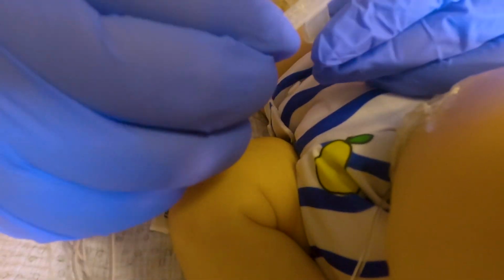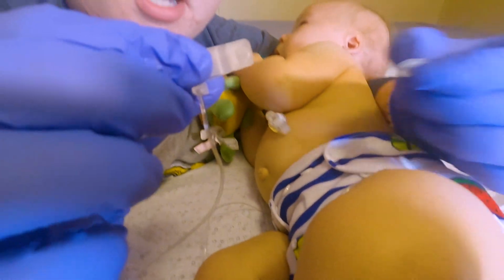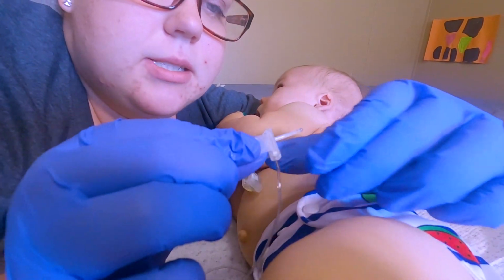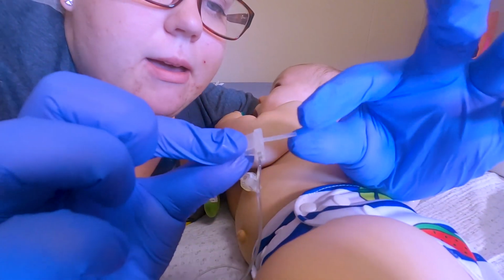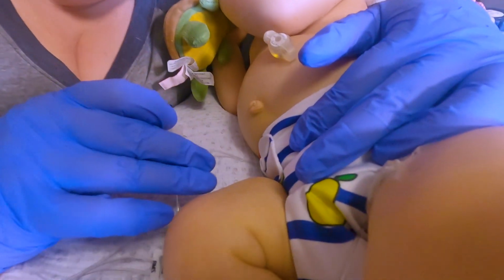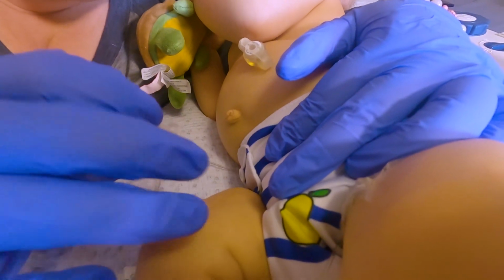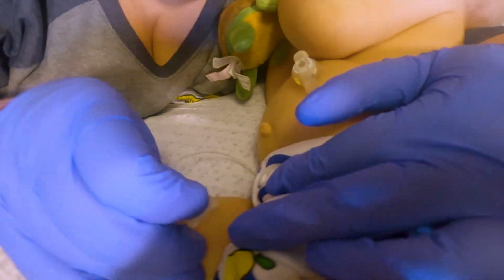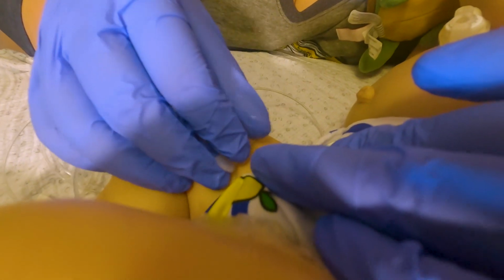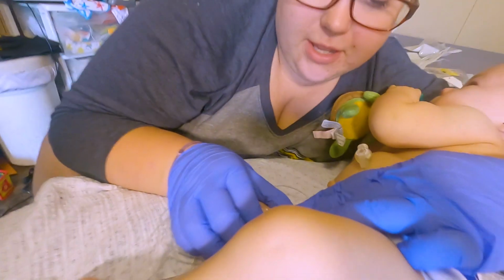So this has a little rubber band on it. I don't think I showed very good. And then it has these little wings. So you take the wings, put them completely back. You take this off. And then the position he's in, it's kind of holding his chunk together. So I can just push on one little side and then you go right where, see? And he didn't cry.